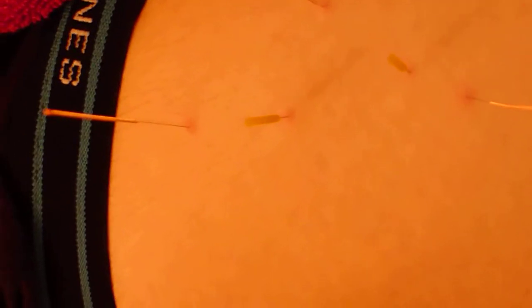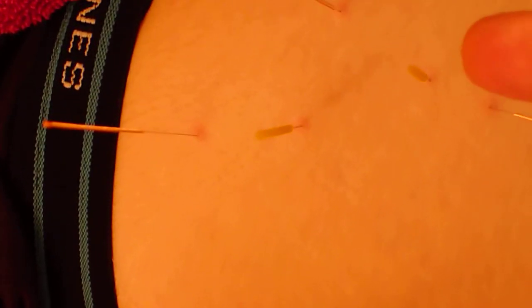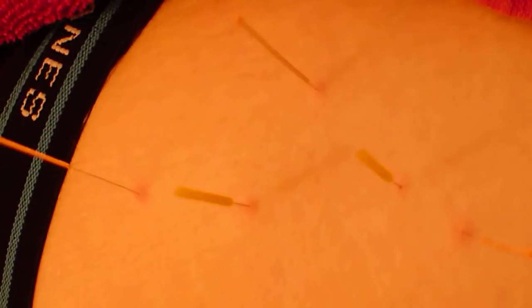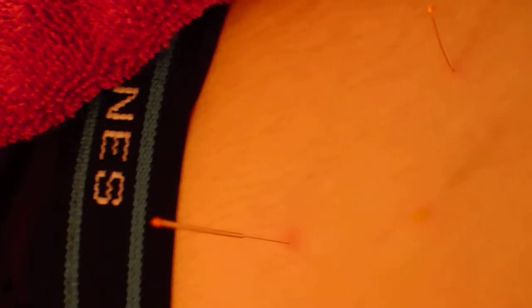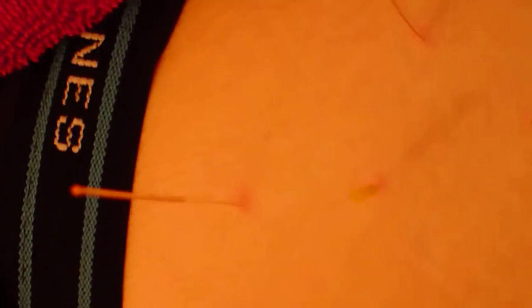Sometimes you'll come in torquing it at a 45-degree angle so that you go underneath the needle that's at the perpendicular angle. So we've got the gluteus medius, we've got the piriformis, and then we've got the often overlooked quadratus femoris, which is distal to — south of — the piriformis. And that's what I've done in the buttock.